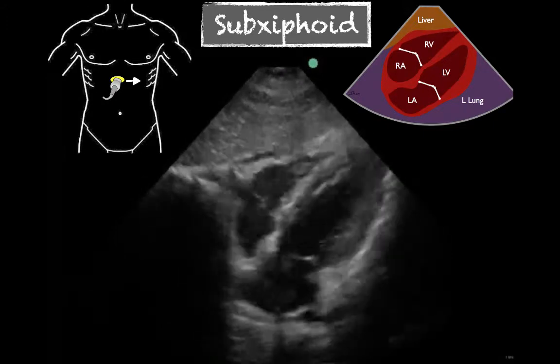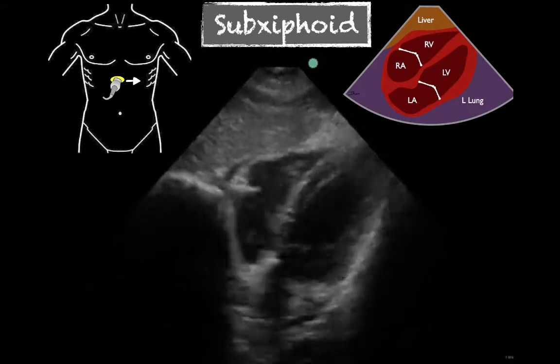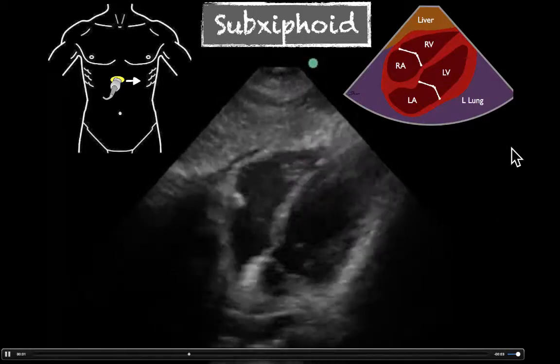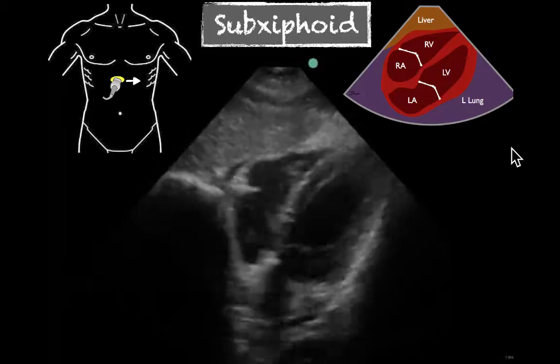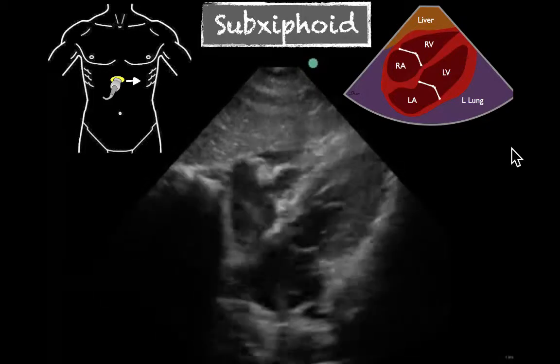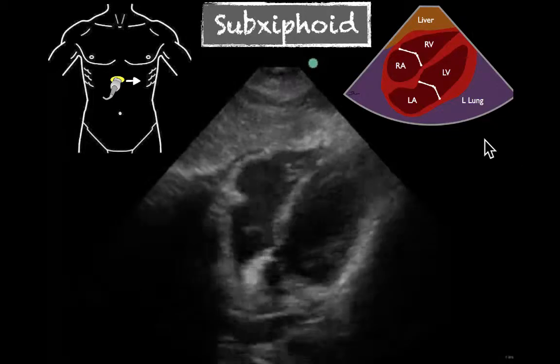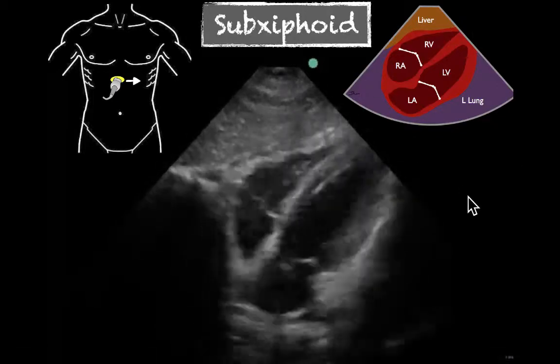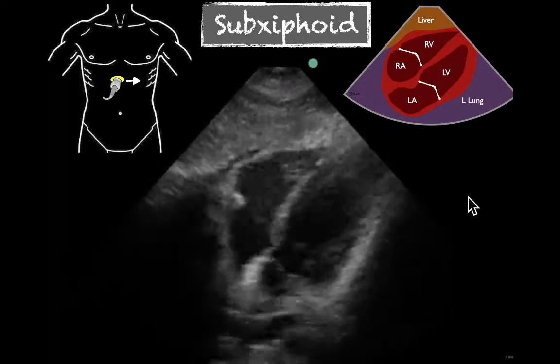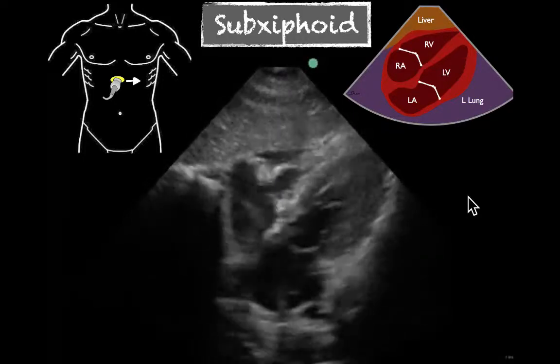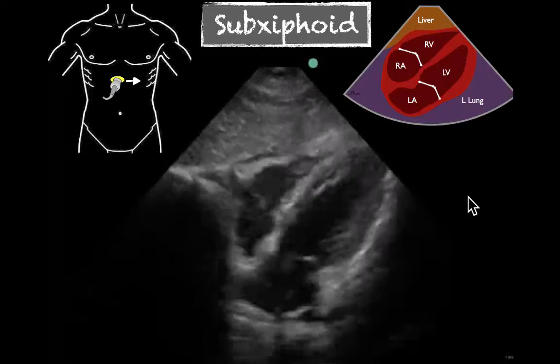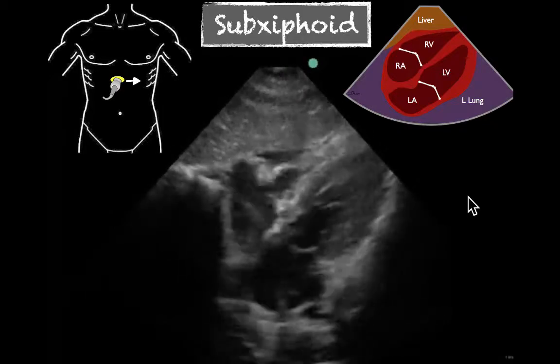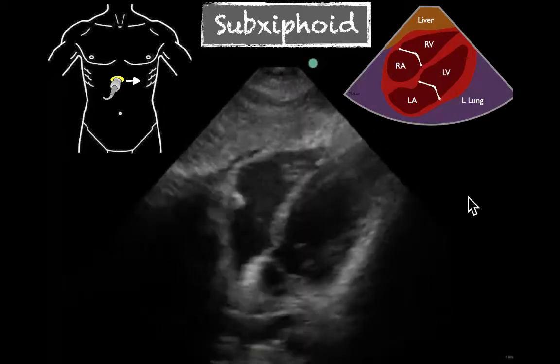When we look at this here, identify your thick chamber — that's going to be your left ventricle, which is right here. We can tell that function is normal. When we're doing this in a cardiac exam, we're going to have our probe marker to the right because we're in a cardiac setting. For those doing this in abdominal settings, such as a FAST exam, your probe marker is going to be towards the patient's right. We can appreciate here that there is a normal ejection fraction and that it is contracting well.